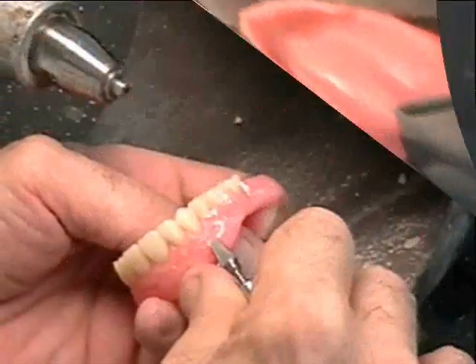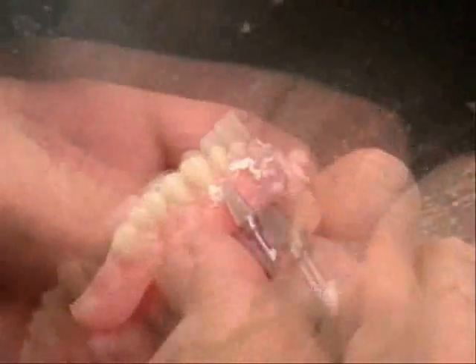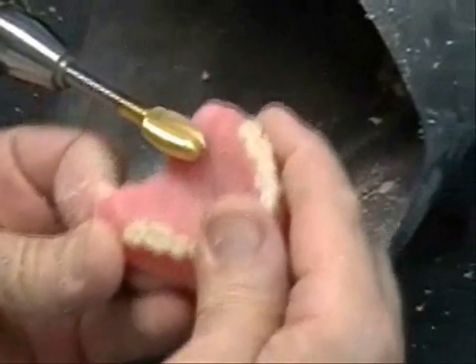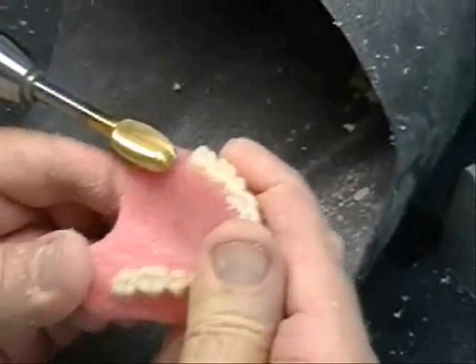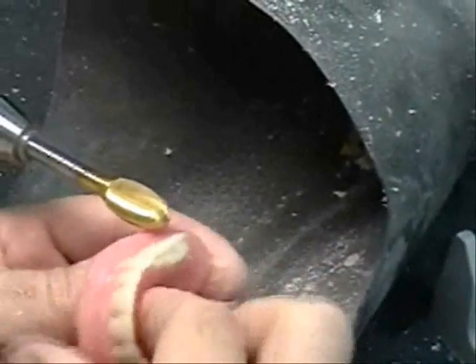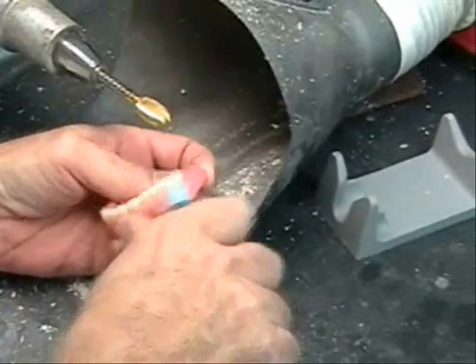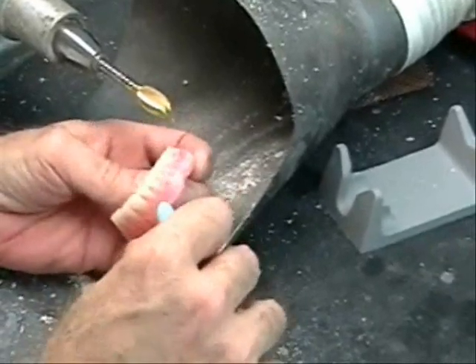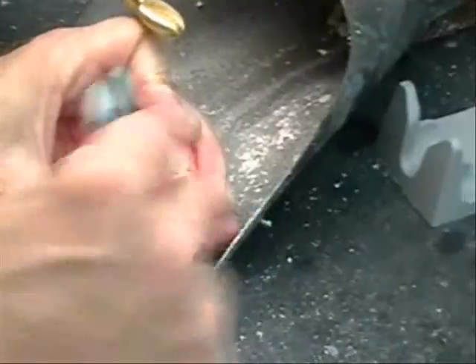A variety of acrylic burrs may be used to further refine denture contours. Abrasive rubber points and wheels may be used to begin finishing what is referred to as the cameo surface of the complete denture. The denture base is now ready for final polishing.